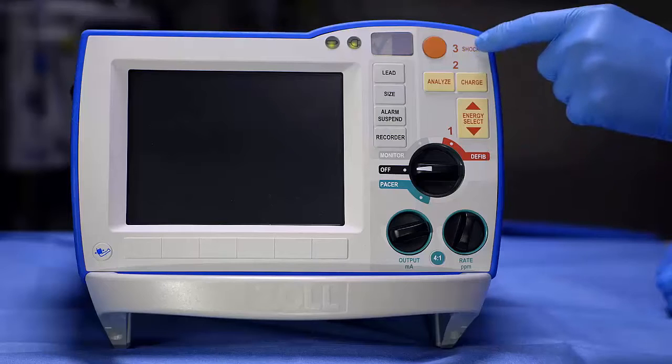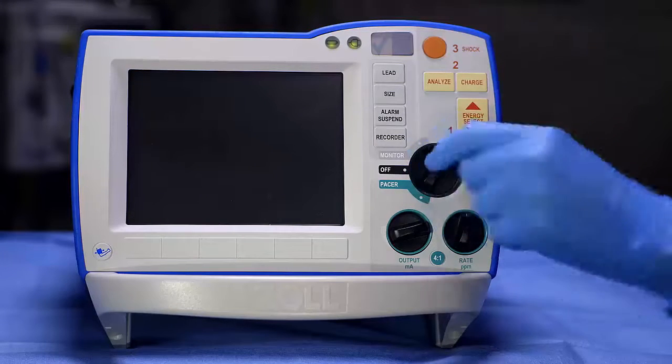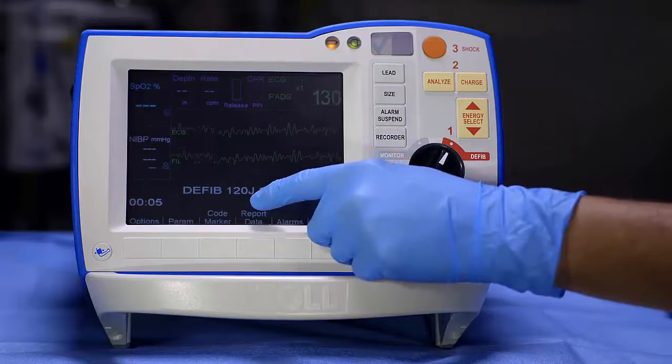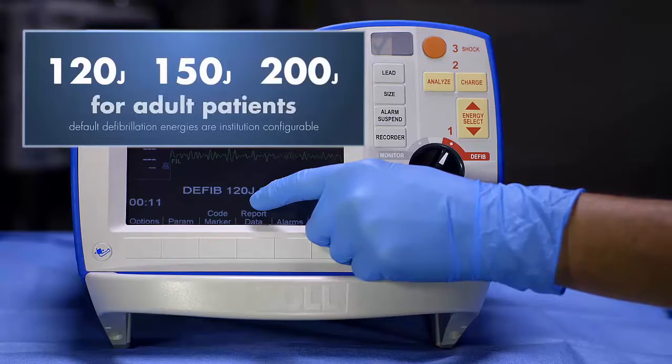Defibrillation is a simple 1-2-3 operation. Step 1: Select defib mode. Note that the defibrillation energy protocol for the Zoll R-series with rectilinear biphasic waveform is 120, 150, 200 joules for adult patients.